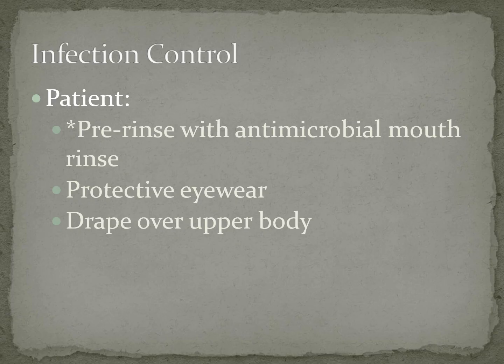Always, always, always have your patient do a pre-procedural rinse, and always make sure it's an antimicrobial rinse. So a fluoride rinse, an anti-cavity rinse, not going to cut it. You have to read the bottle, make sure it says antimicrobial. Okay, so always have your patient do an antimicrobial rinse before you use the ultrasonic scaler. And in our clinic, since they're so long, if you have the patient do a pre-procedural rinse, say possibly when they first sit down, and you don't ultrasonic for another hour and a half, have them do the pre-procedural rinse again. Okay, it's not going to hurt anything. It's just topical. They're swishing with it and spitting it out.